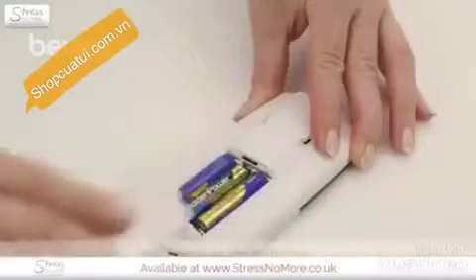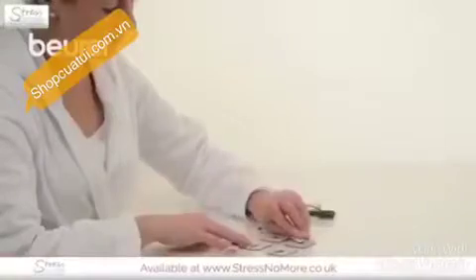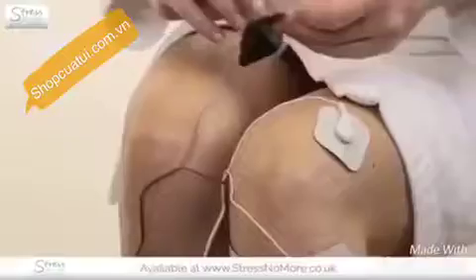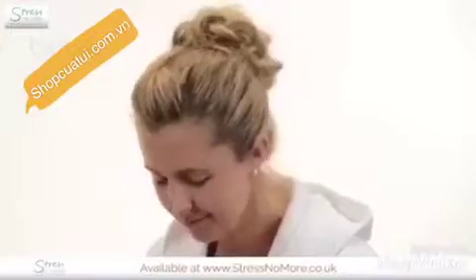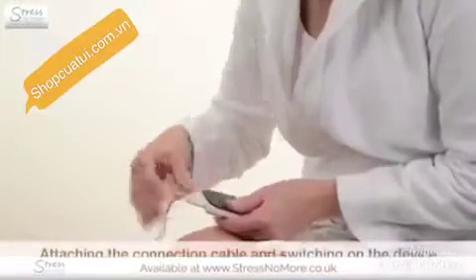Insert the batteries provided. Then connect the connection cables with the electrodes and position the electrodes — the overview shows you how to do this. Please ensure that a distance of 5 to 15 cm between the electrodes is maintained. Connect the connection cable to the device and switch it on.